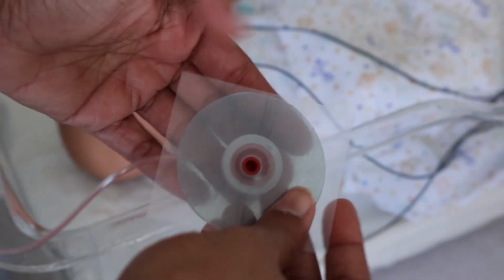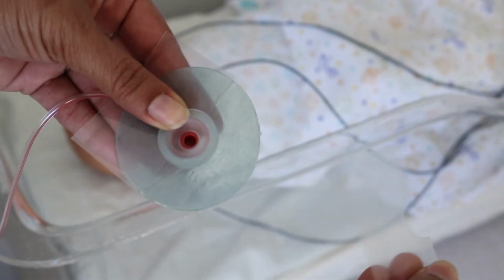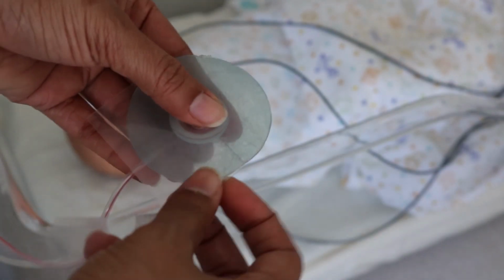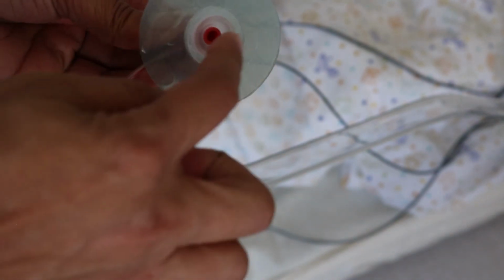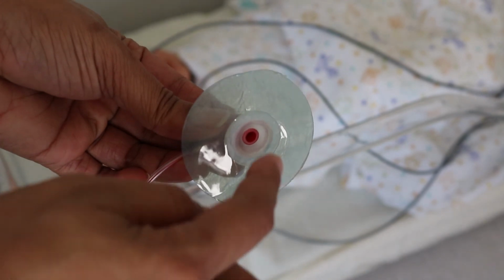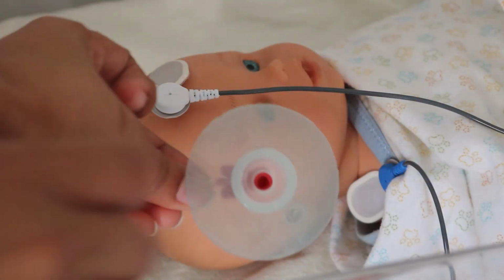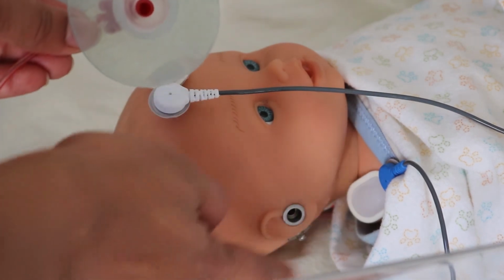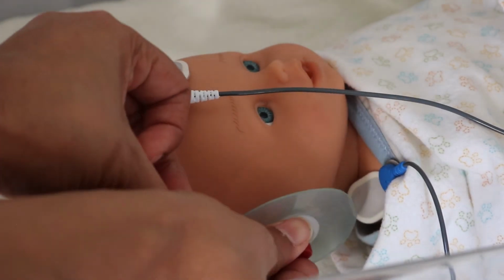Hold the earhugs with one hand, then peel one side of the clear protective backing from the center and out. Remove the second half of the earhug backing from the center out. Avoid handling the gel area to preserve its adhesive qualities. Position the earhugs over the baby's ear. Align the center of the dome with the opening of the ear canal.